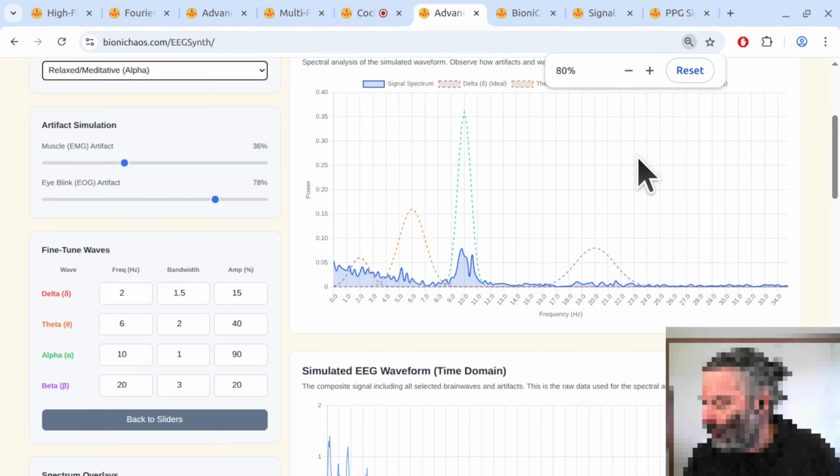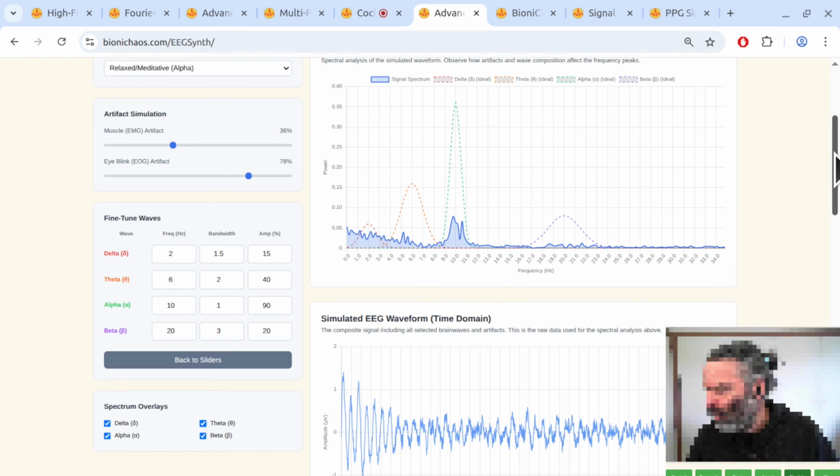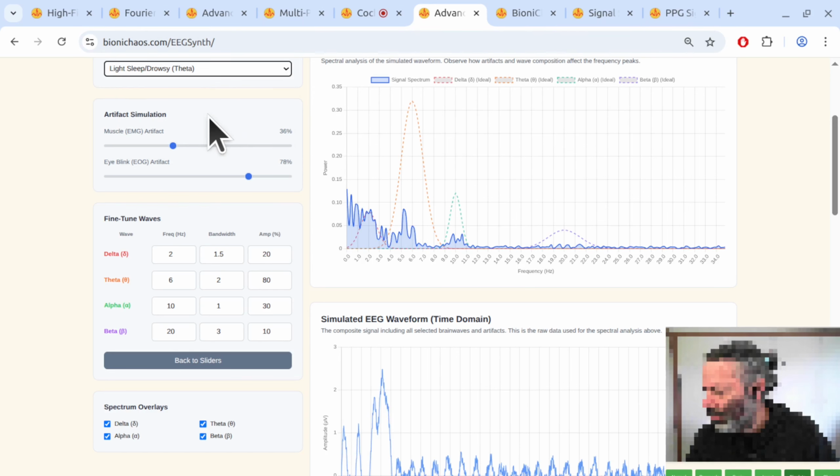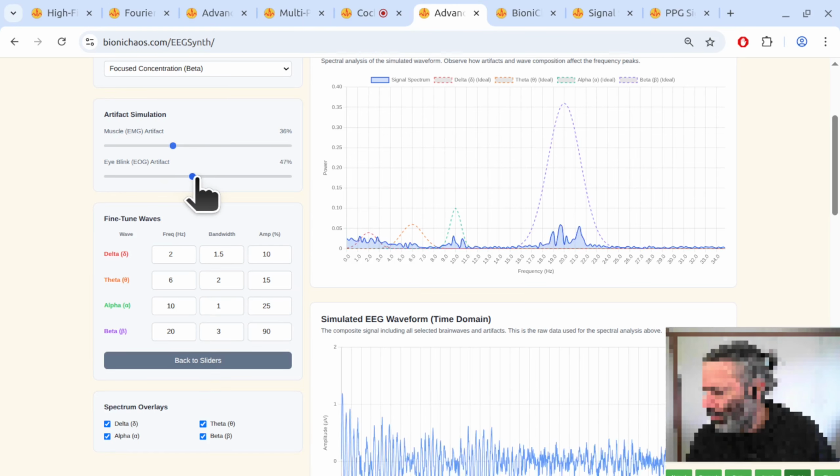Yeah, and what's really key here is EEG's specific edge. It's non-invasive, pretty cost-effective, and captures brain electricity with incredibly high time resolution. Ultra high time resolution. Why is that so critical? Well, it means we see brain activity almost the instant it happens.